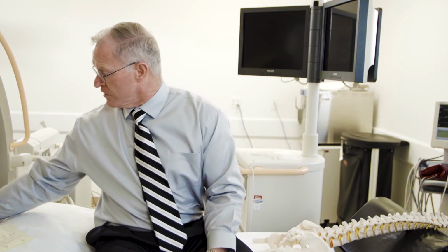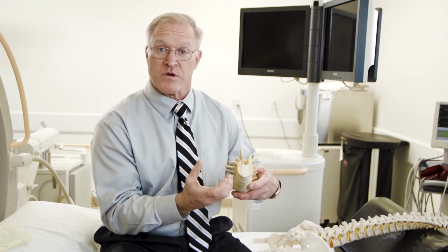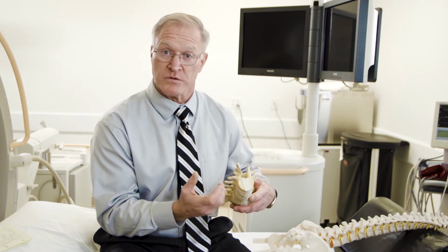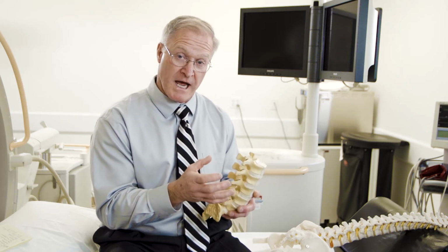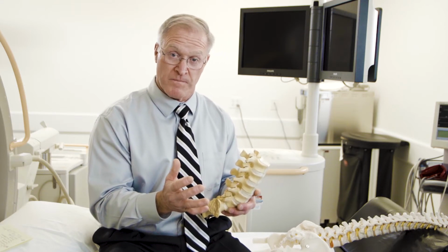If you look at your lower spine, you'll have a spinal canal, and inside that spinal canal there's an actual tube with a leathery bag containing the spinal cord and spinal roots. With an epidural, our job is to very carefully and comfortably place a small needle into the space inside the spinal canal, but stay outside of the leathery bag that contains the spinal cord and roots.